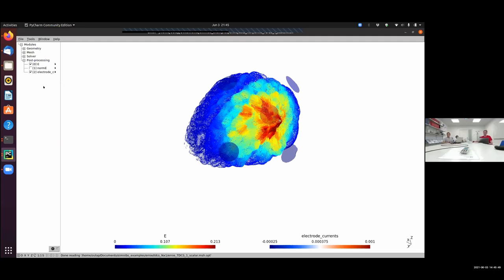If I want to remove non-brain tissues, including electrodes, skull, and so on. So in case you want to remove the non-brain tissues only from the simulation results, so that we don't see all the fields also in skull and skin and so on, but only see how the field looks like in the brain, then you can simply apply a mask. It's just loading in the file, multiplying it with the mask, and then visualizing it.